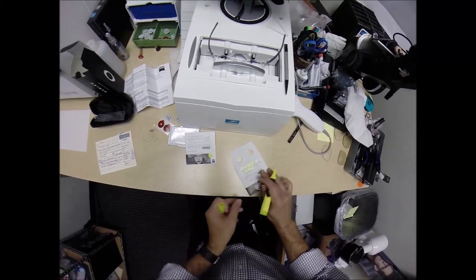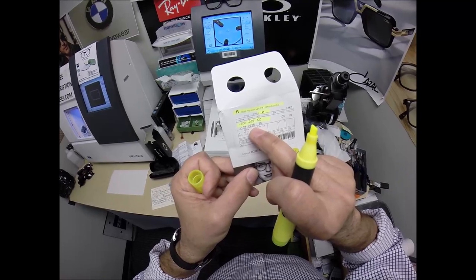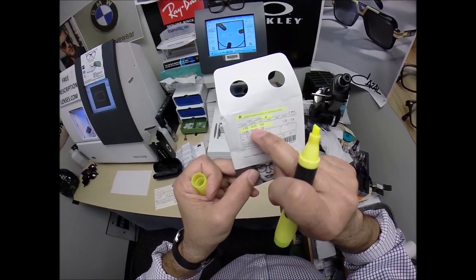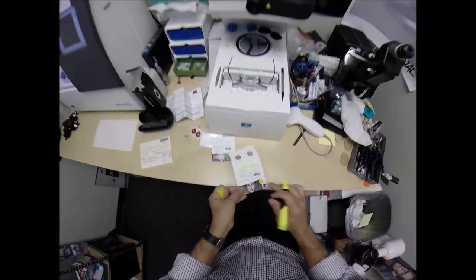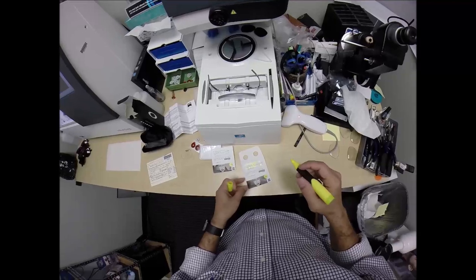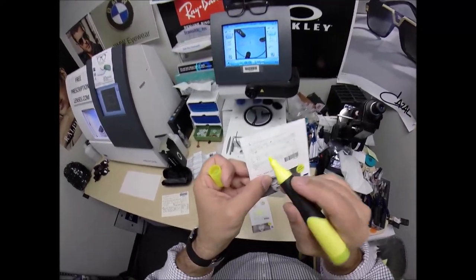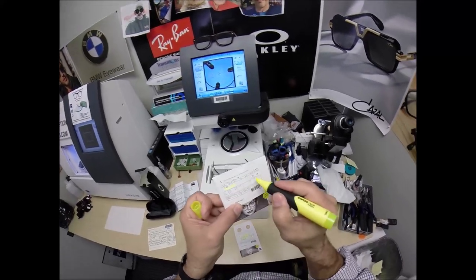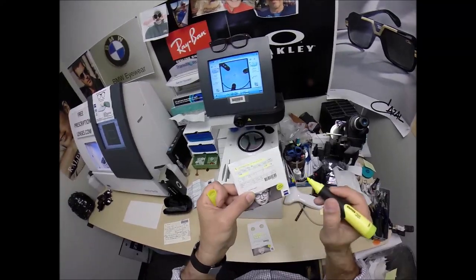That is your prescription. And minus cylinder, doctors, some old school doctors write in plus cylinder. Opticians do everything in minus cylinder, so that's why that's there. 125 is the power of your progressive. And let's go ahead and highlight the left while we're here. Only a -1 sphere for the left eye, 1.25 strength for the progressive, all that information just like that.